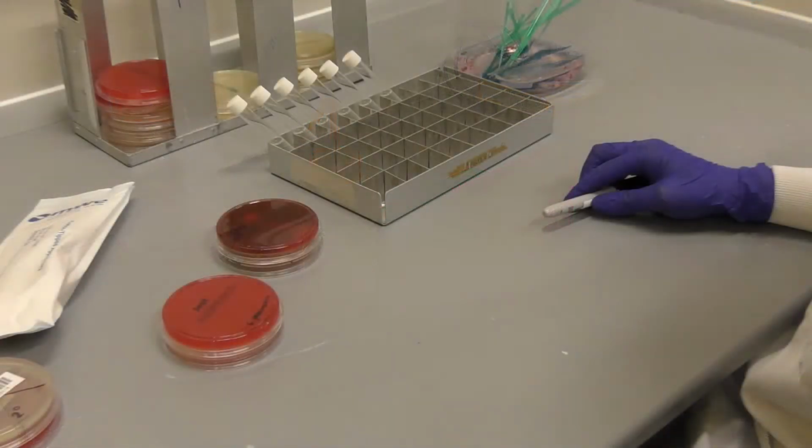This video covers setting up E-tests for antibiotic sensitivity testing for the pure isolates grown from either your antibiotic sensitivity plate or from secondary streak purity plates. Make sure that the agar plates that you're using will have been brought to room temperature and completely dry. This is key to ensuring an even bacterial lawn when inoculating.